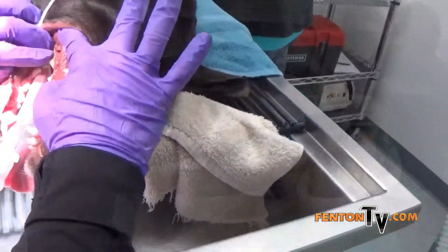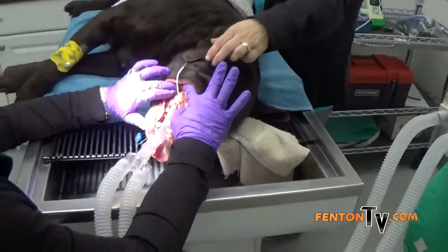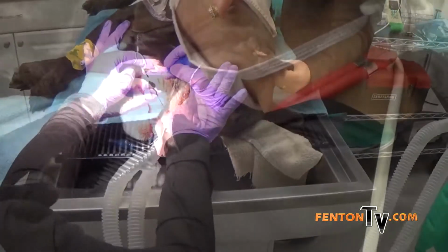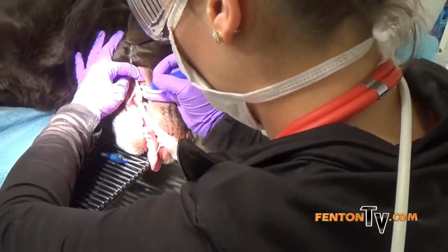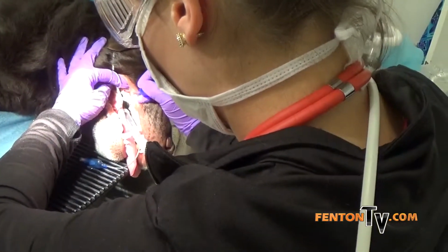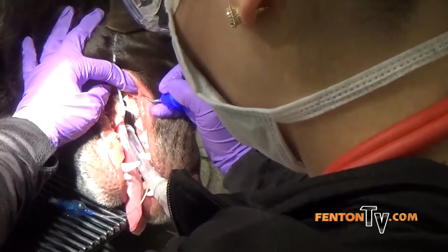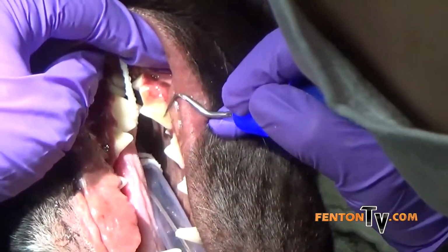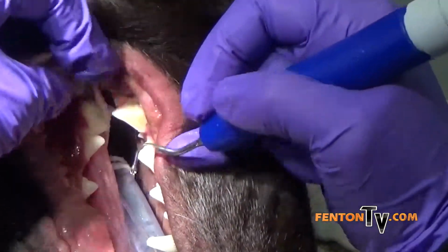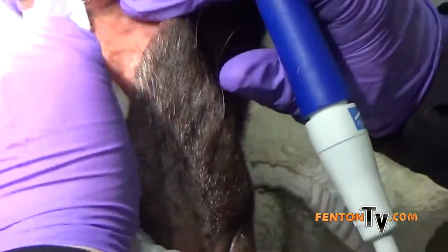To the other one, so you can see the tartar built up there, and we are going to remove that. And just like us, when we don't floss, our gums bleed a little bit.